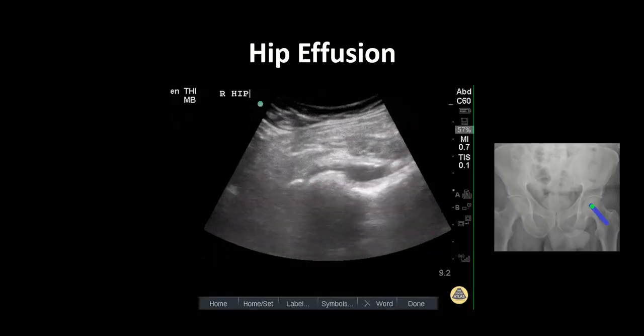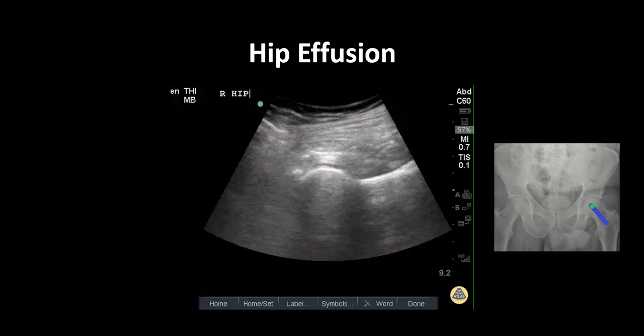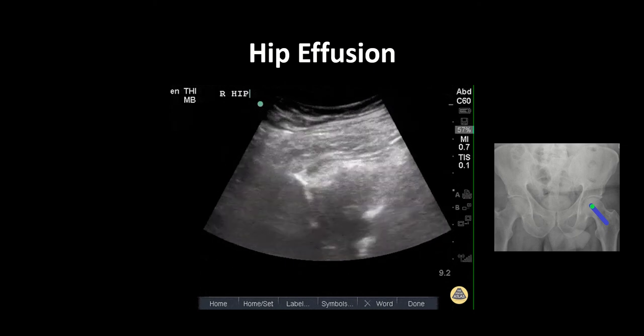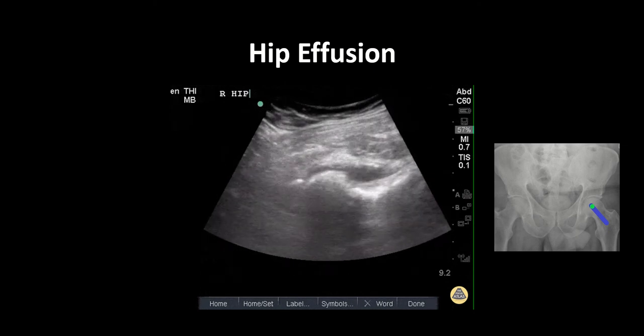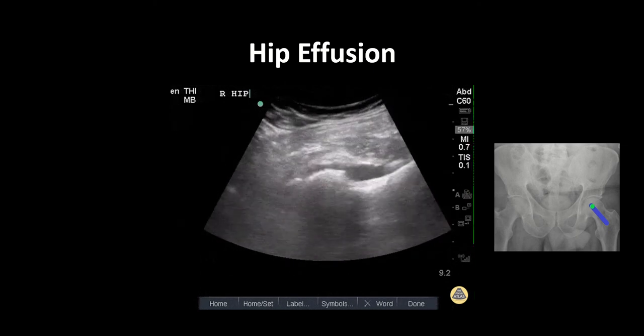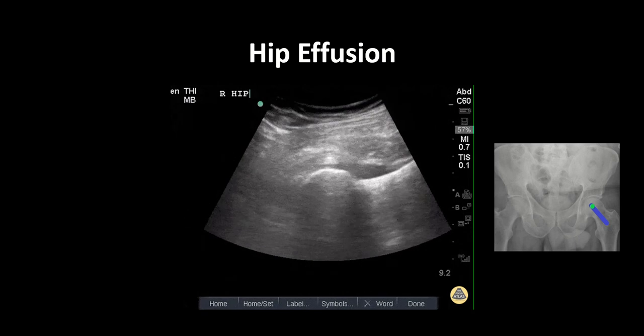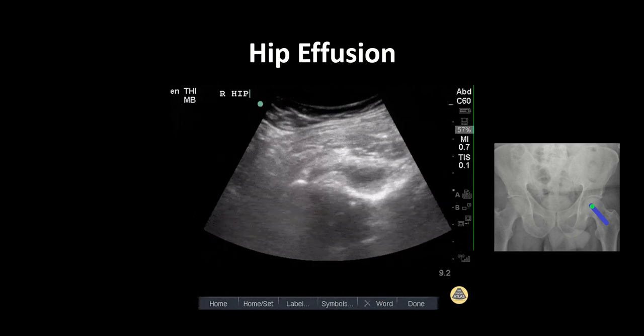In patients presenting with atraumatic, image-negative hip pain, ultrasound can help evaluate for the presence of a hip effusion, expediting the workup and management of a potential septic joint.